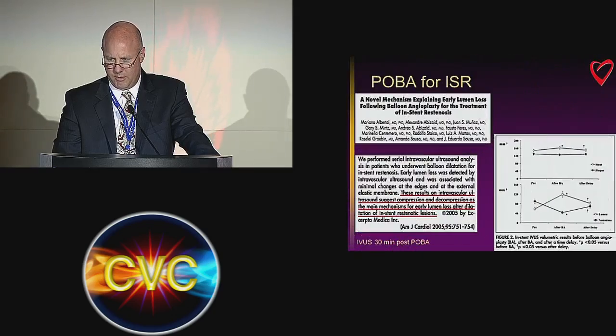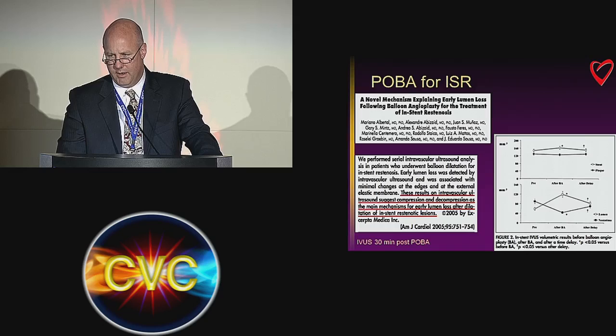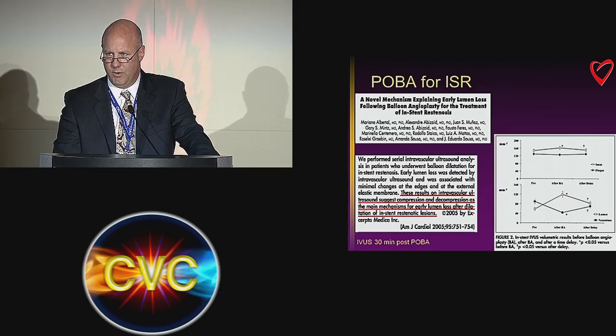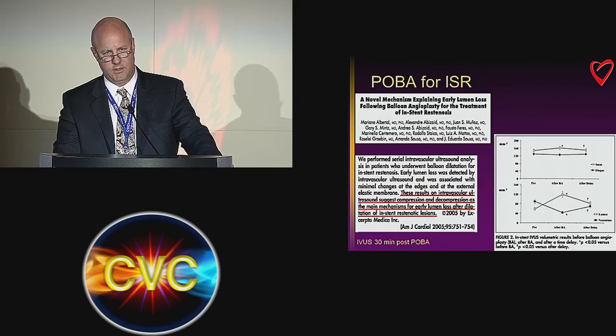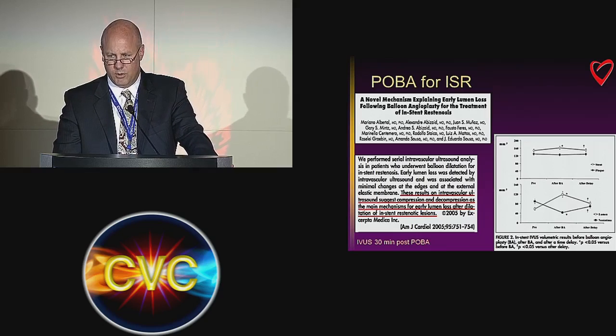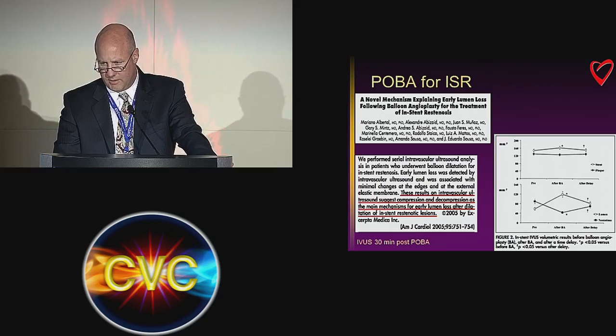This data was published 10 plus years ago out of Gary Mintz's lab using intravascular ultrasound in coronary arteries. It's a very simple study that we think about doing but don't do in our own labs, where you dilate an artery and IVUS it before and after, but then you come back 30 minutes later and IVUS it. Most of us dilate things and it looks good, and we pat ourselves on the back and go home and think everything's great.